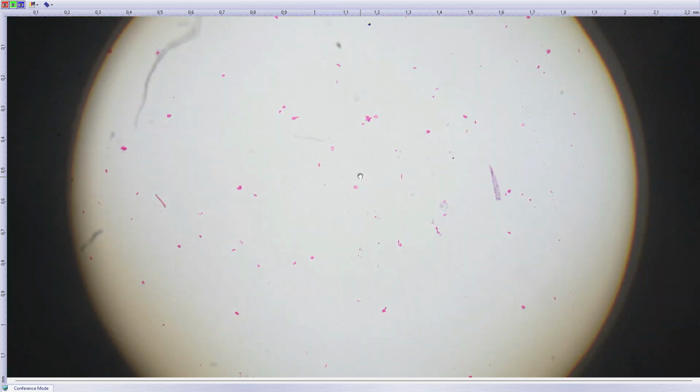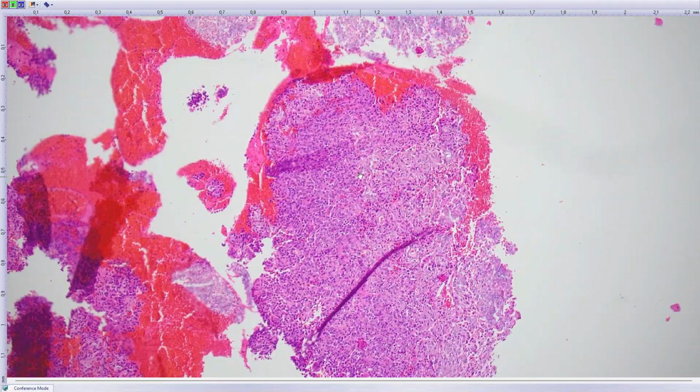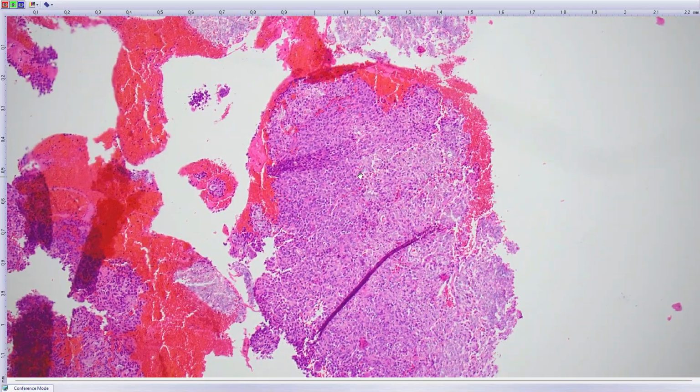Also, about half to two-thirds of phosphaturic mesenchymal tumors have FN1 fusions. This case didn't have the fusion detectable, but still the morphology is typical of that. I think the location is very, very common. Head and neck is a good location for phosphaturic mesenchymal tumors. It's a very rare tumor we see here, maybe one case a year at most.